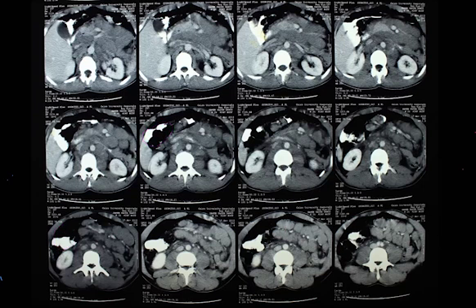Yes. So why don't they contain contrast? Because you can never fill the bowel loops homogeneously with contrast. They fill according to their rate of gastric evacuation and according to the peristalsis. If you want to ensure better contrast filling, then you have to pass a tube inside the duodenum so that you control the degree of filling of the bowel loops. But it's cumbersome to pass, and it's not the standard.